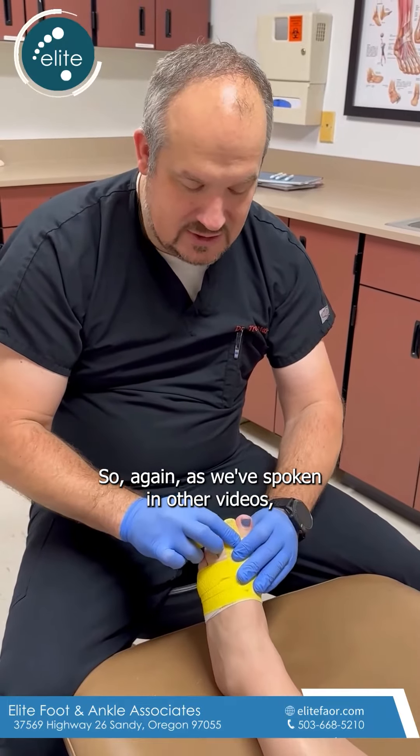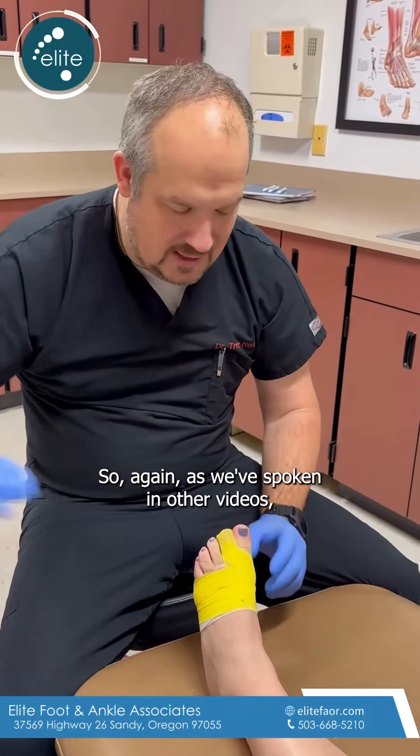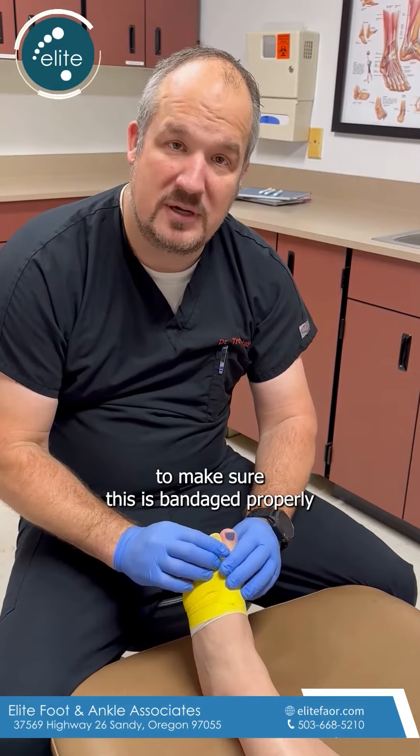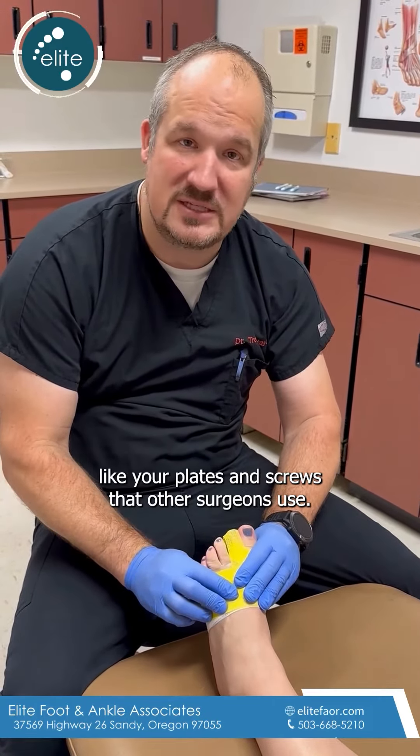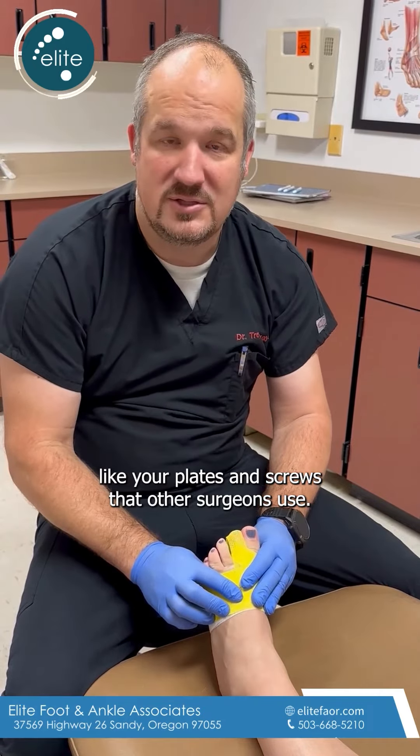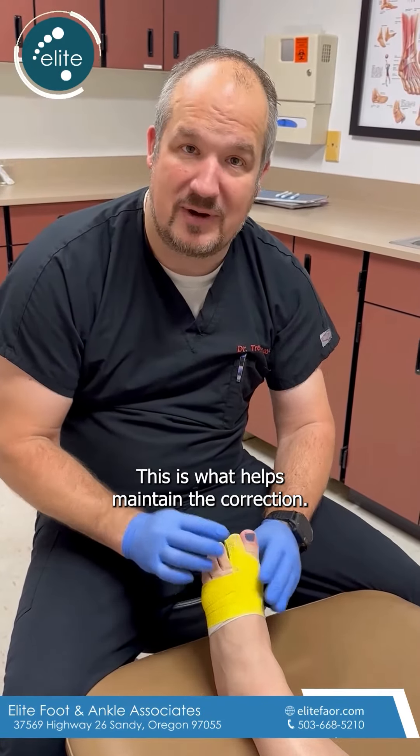As we've spoken about in other videos, it's super important to make sure this is bandaged properly, because this bandage is actually working like the plates and screws that other surgeons use — this is what helps maintain the correction.